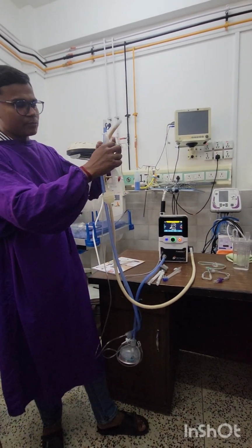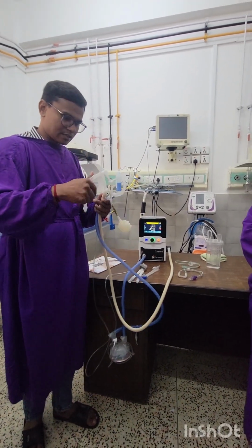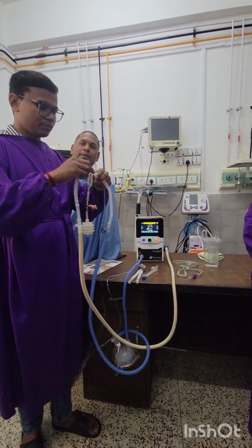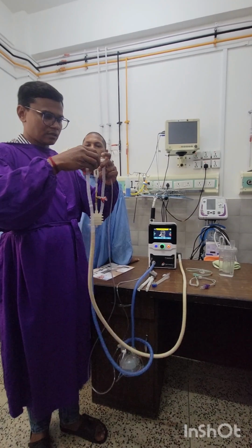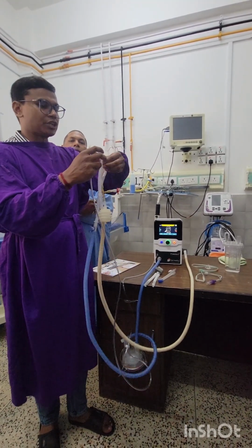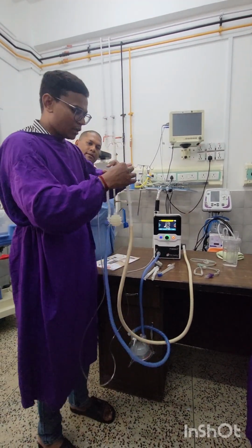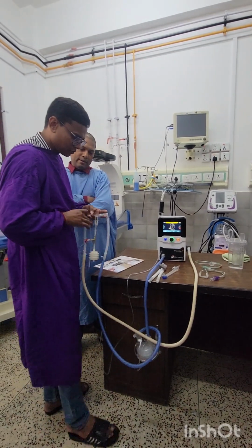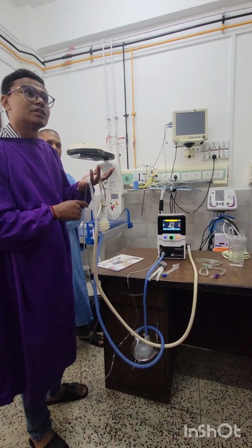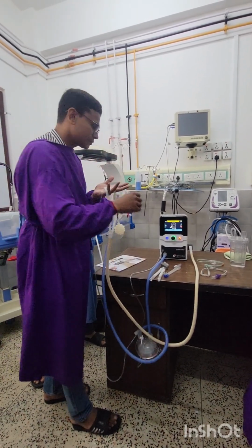So right now I am just setting up this device. Just like this, you can attach your baby. I have attached it. This is a circuit. You have attached the interface, and there is a proximal pressure line here, which is continuously monitoring the delivered pressure to the baby. Right? And this is the setup. Now, one by one, we will start the therapy and explain it to you. Is this for oxygen or any sensor? Pressure. What does it measure? Real-time pressure delivered to the baby, at the nearest point to the baby.